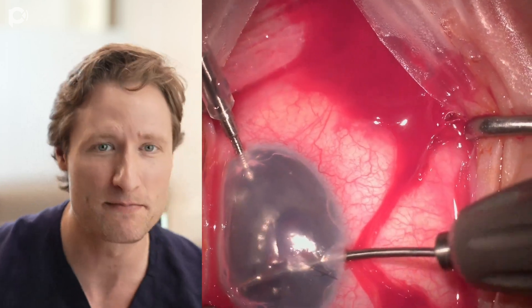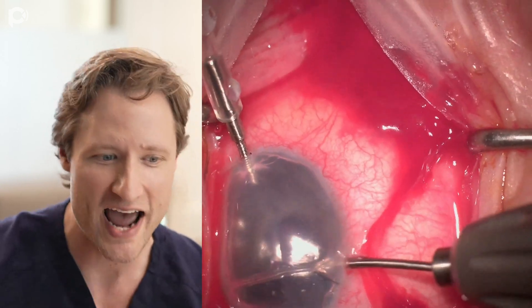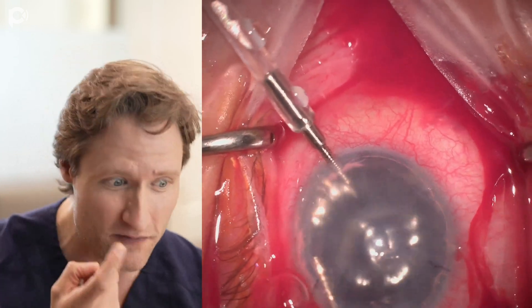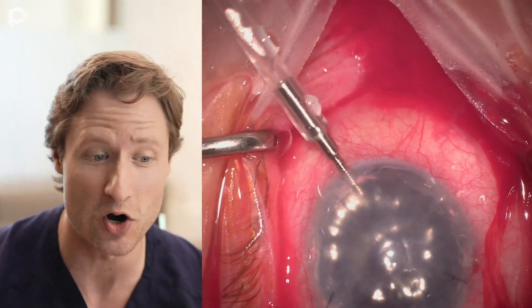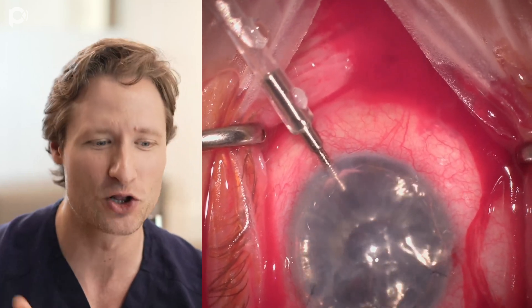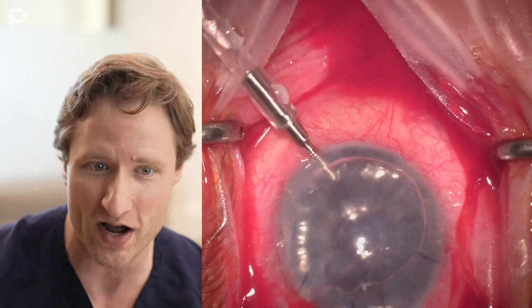What I'm doing now is going around with coaxial forceps, using the main wound and a variety of paracenteses, trying to tactilely feel around and engage little lingering strips of Descemet's membrane that I was unable to liberate using the inverted Sinskey hook or the Mela scraper. This is so important because they're often difficult to engage any other way, and you need to remove them so they don't interfere with attachment and don't make the eye look ugly. Whenever I am replacing a DSEC with a DMEC, I always have these coaxial forceps on the tray.